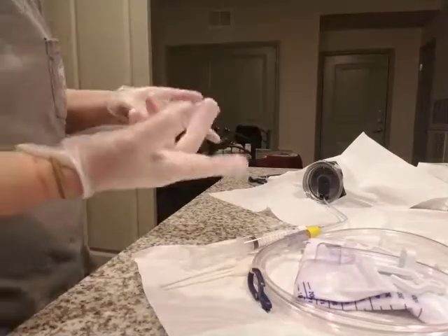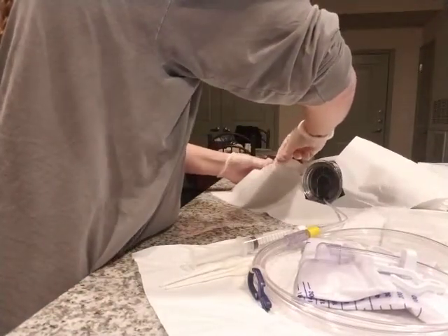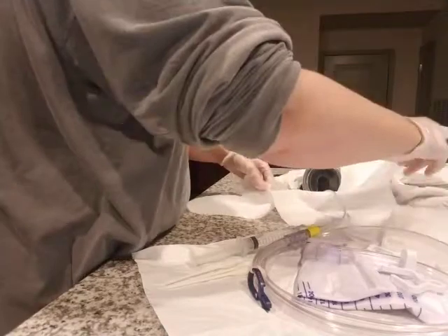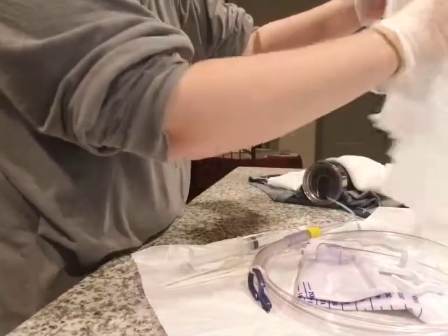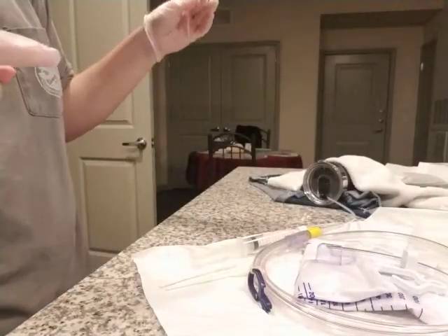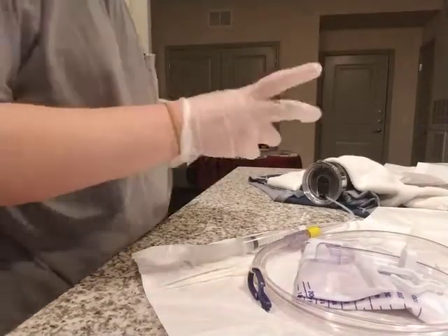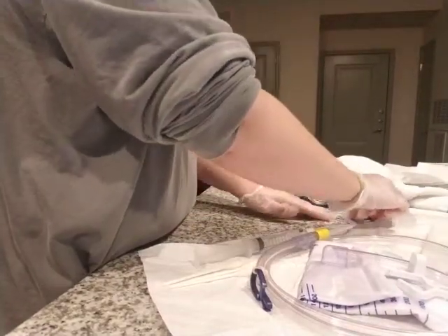I'm now going to remove the sterile drape. And then I'm going to secure the catheter onto the patient's inner thigh with the hypoallergenic tape. So let's imagine this is the patient's inner thigh. Feels right.